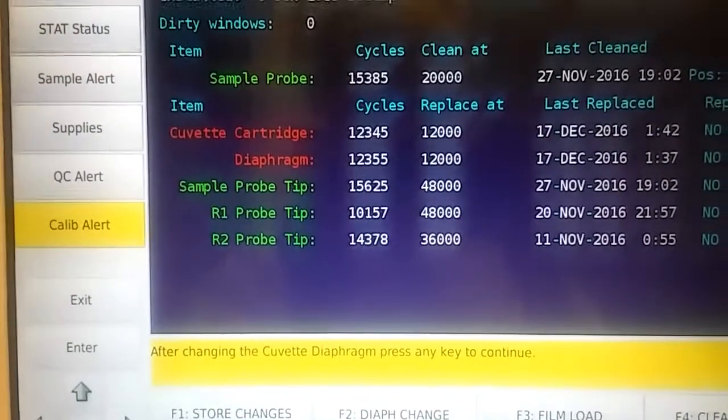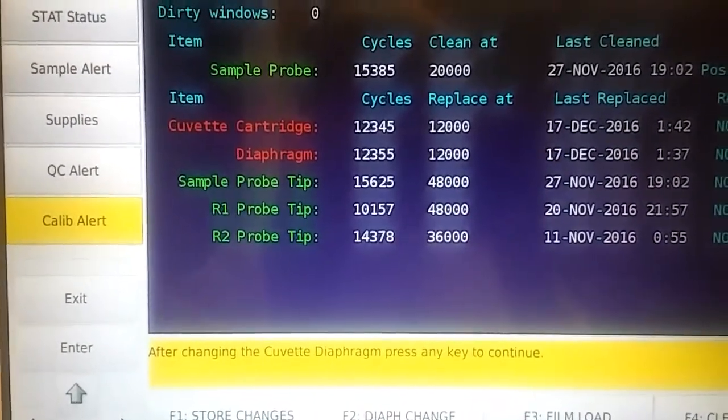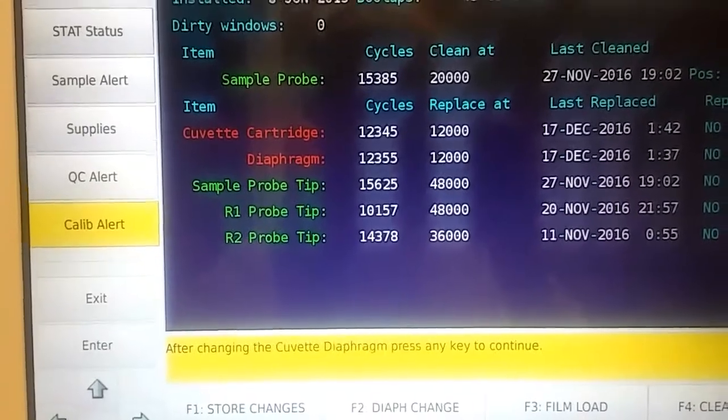Before I changed the diaphragm, I went ahead and changed the cuvette because usually they both go out together. I just cut the tape about halfway down and then re-taped the red tape from the new cuvette cartridge.